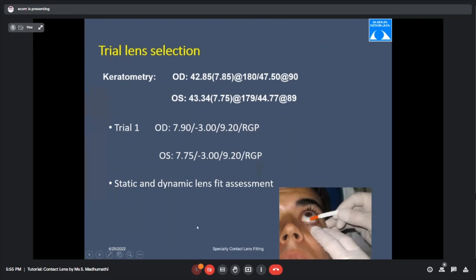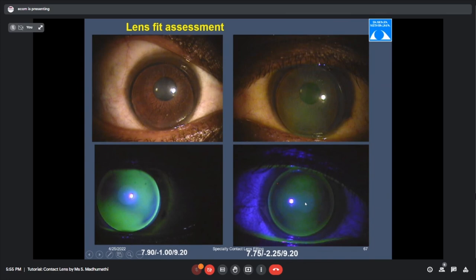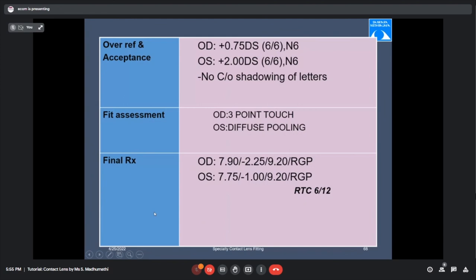A larger diameter lens was prescribed for the oval cone. Static and dynamic fit assessment was done. Fluorescent pattern for left eye showed diffuse pooling; right eye showed a 3-point touch pattern — touch at the apex of the cone and two peripheral touches. Vision improved to 6/6 in both eyes and patient was happy with the lenses. We prescribed the lenses, but advised the patient to have lenses for a minimal supply period since KC can progress.